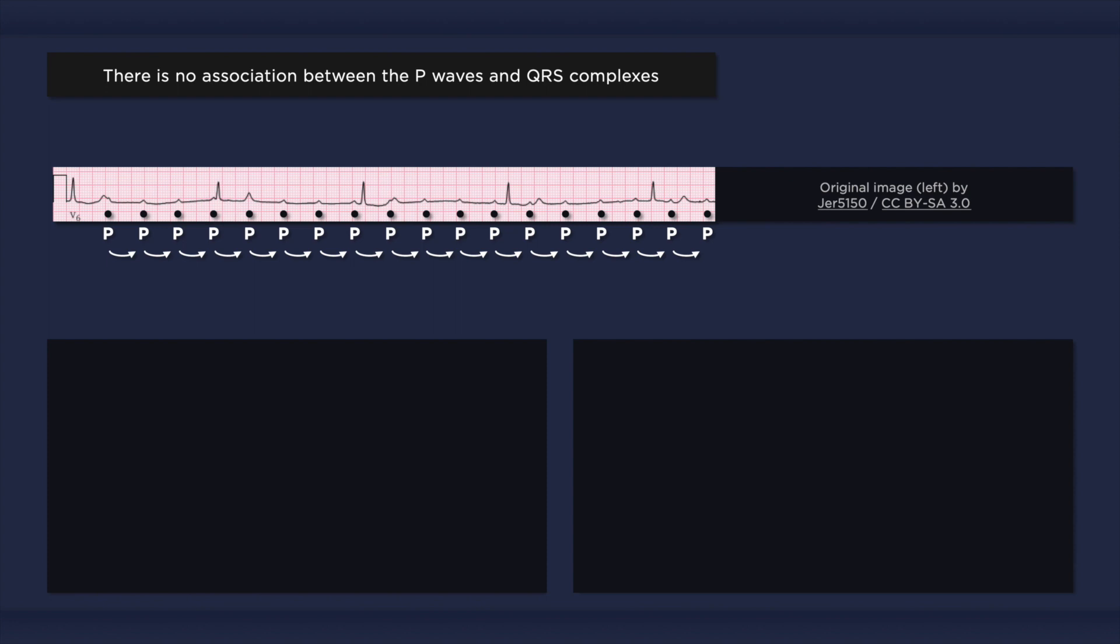Now let's take a look at the QRS complexes. They are also occurring at a regular rate of about 27 beats per minute. Note how the QRS complexes are occurring at regular intervals with no relation to the P waves whatsoever. The P waves are simply not conducting to the ventricles, and thus do not initiate any QRS complexes. The QRS complexes that emerge are due to an escape rhythm, which is slower than the sinus rate.